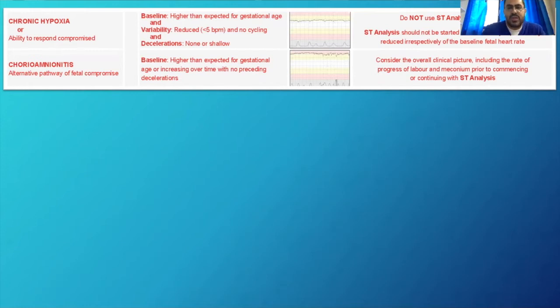We should not be putting this baby into further stress or any hypoxia. And this baby we should be considering delivering as soon as possible with the fastest, least interventive way if we can. As in, if she's almost fully dilated and she's about to push the baby out, fine, but otherwise we would usually err on the side of a cesarean section, just for safety of this baby.